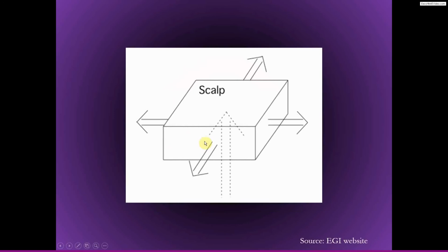With EEG, but not with MEG, there is an additional source of annoyance: as soon as the electrical fields hit the scalp, or the border between the skull and the scalp, they also spread laterally across the scalp. This is a unique problem for EEG because magnetic fields go right through all these tissues unimpeded.